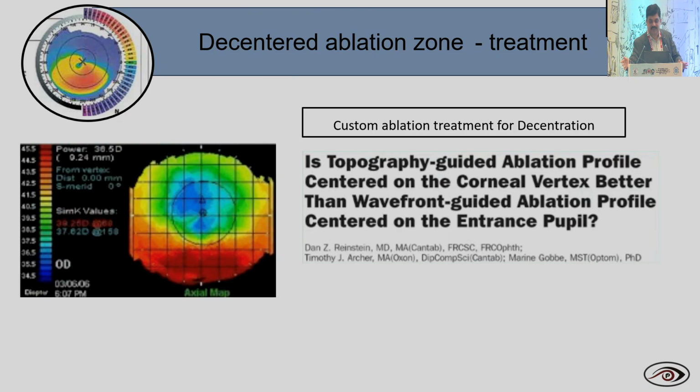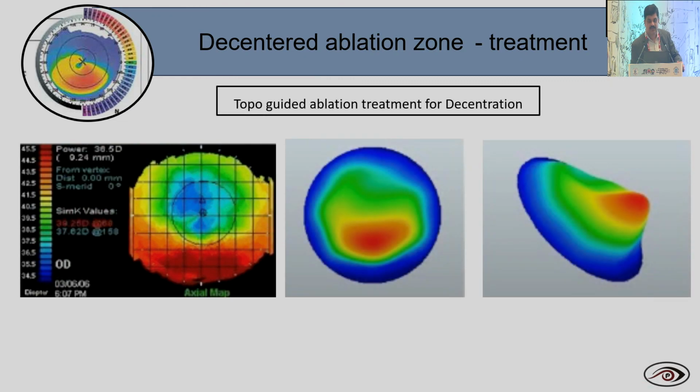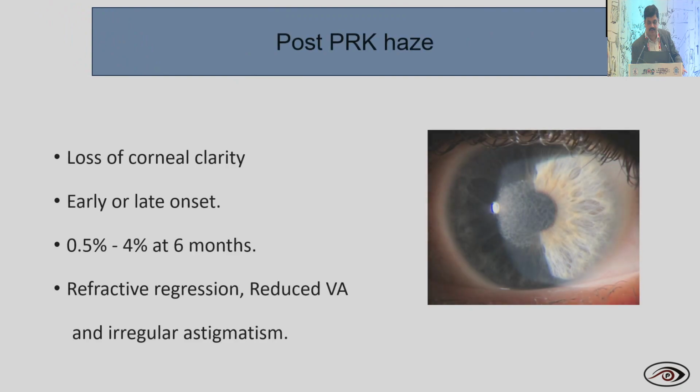Most of the studies show that the topo-guided treatment will be much better than the wavefront-guided treatment. So this is about the topo-guided ablation for the decentered treatment. You can see there is a lot of change from the pre-treatment to the post-treatment, which is well centered with respect to the visual axis.